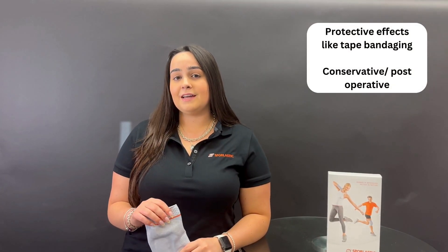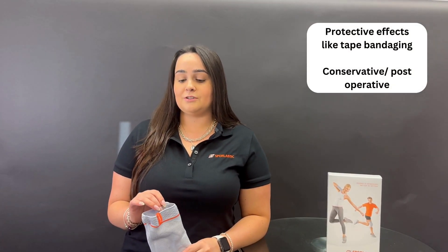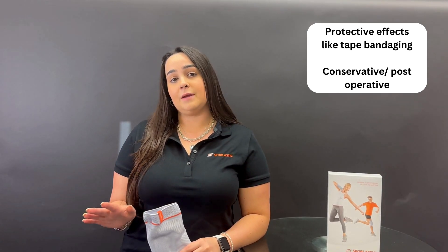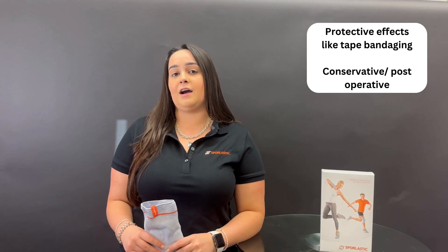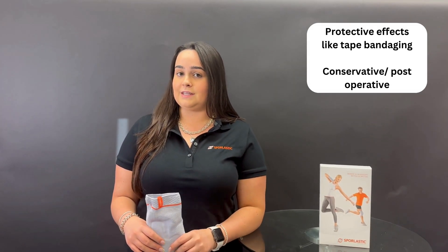The fibula tape was designed to be an alternative and to provide more support than the tape bandaging that a lot of people do on their ankles after they've sustained injuries or if they have reoccurring sprains and strains in the ankles.